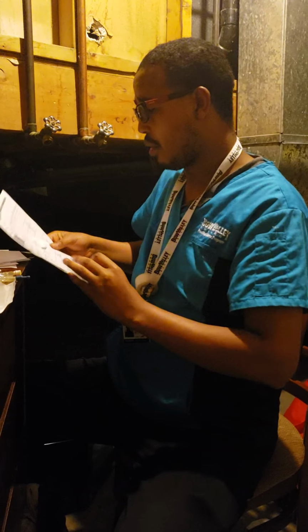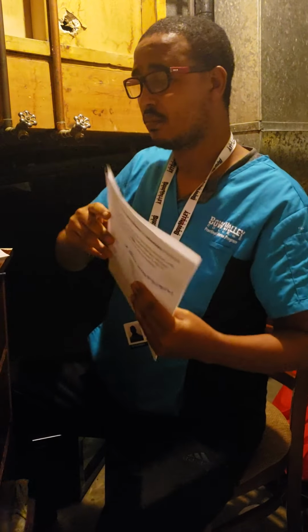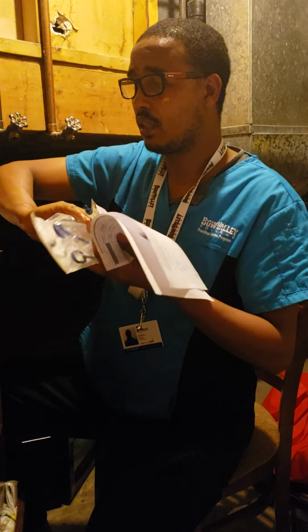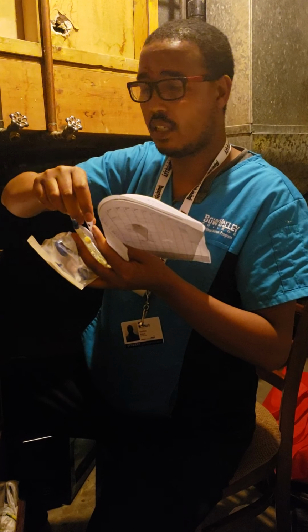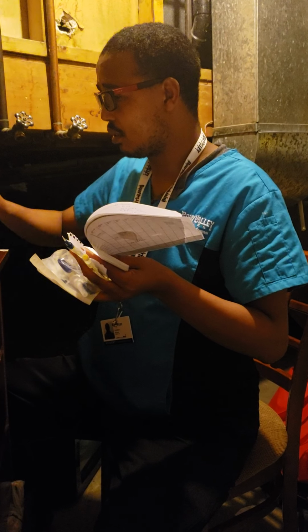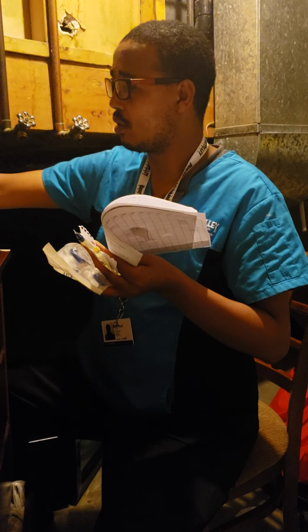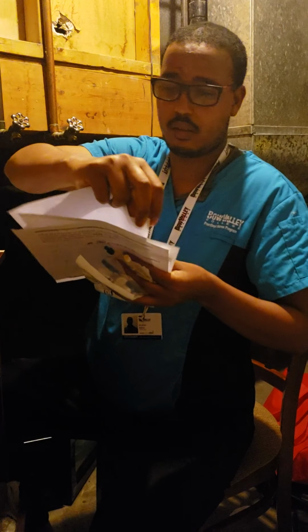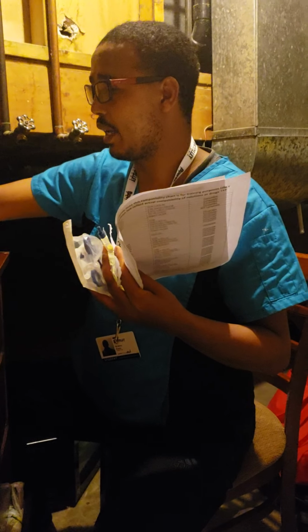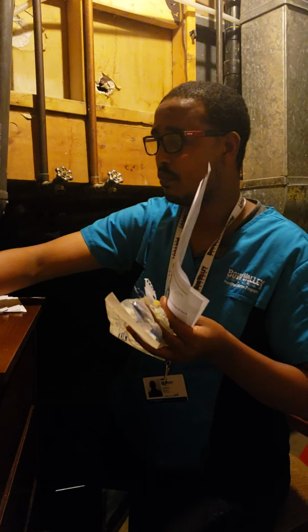I have to have my MAR, my information, my medication, secondary IV tubing, labeling for my secondary IV line, and my monograph, my compatibility, and my alcohol swab. So I'm going to go to my patient room.